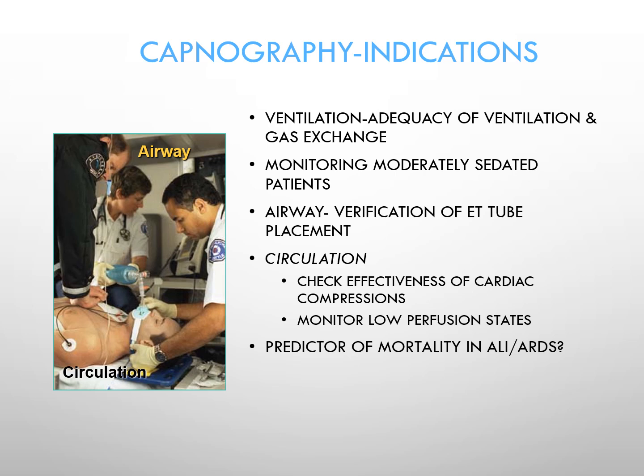However, those same medications can result in a suppression or depression of ventilation and can cause the buildup of CO2, which can be detected if the patient is indeed interfaced with capnographic equipment.